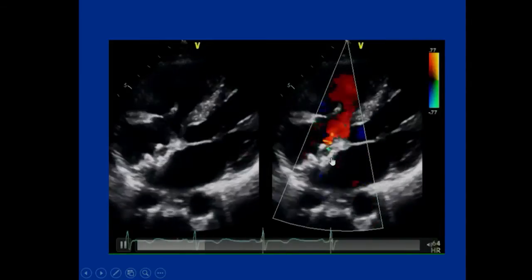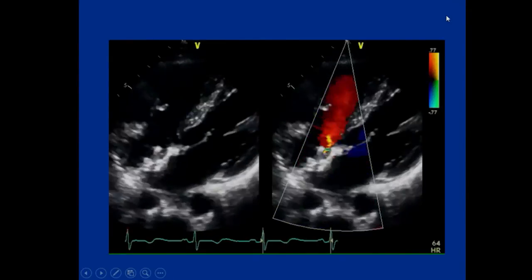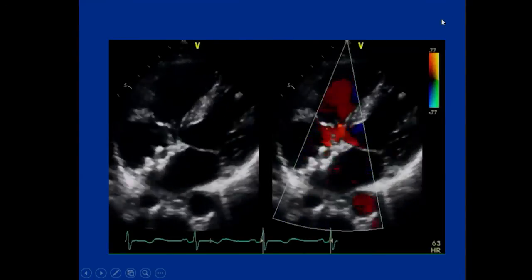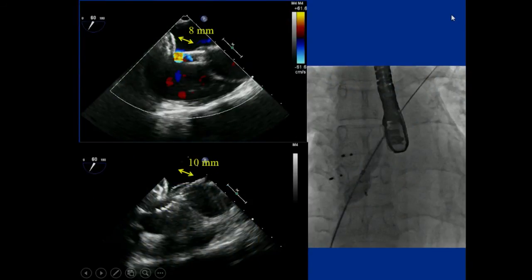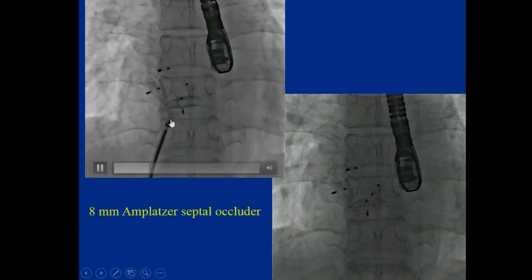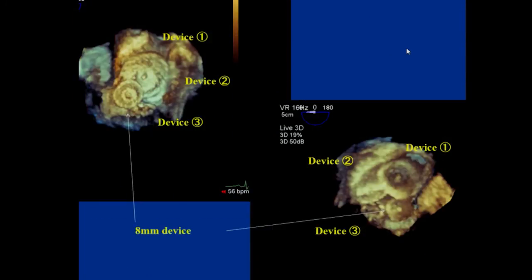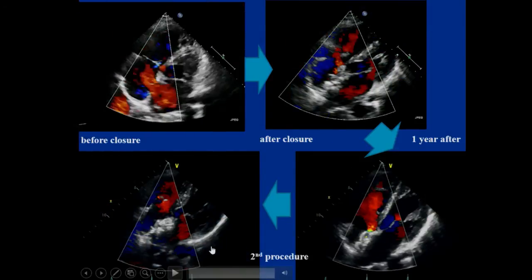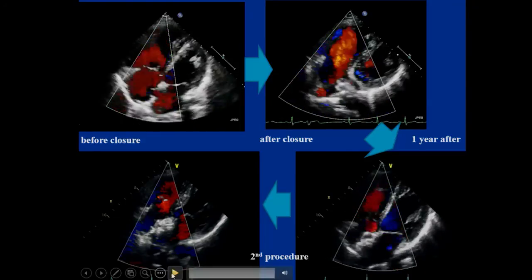One year after the procedure, the shunt persisted. The patient came back to the clinic and asked to close one more defect, as she had no trouble from the previous procedures. So we closed the remaining 10mm defect one year after the first procedure with one more device. Despite having four devices, the patient had no atrial arrhythmias and finally achieved complete closure.